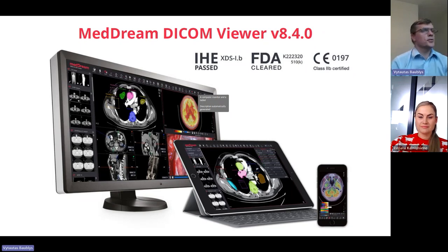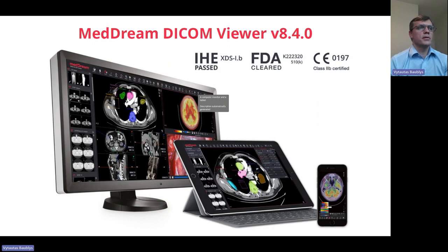So I'm starting. I'm very proud to announce the 8.4 version, which will be officially available since next Friday. It's already implemented in our pilot hospitals for more than a week. The final improvements are finished, and at the latest next Friday it will be officially available on our website to download and upgrade your systems. So I'm very happy about this release.